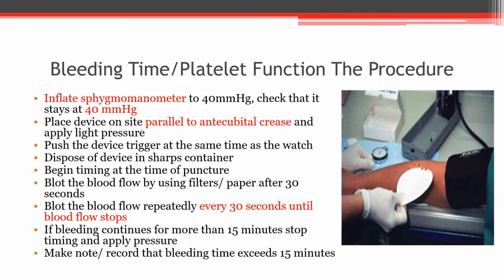Blot the blood flow using filter paper after 30 seconds. Blot the blood flow repeatedly every 30 seconds until blood flow stops. If bleeding continues for more than 15 minutes, stop timing and apply pressure. Make a note that bleeding time exceeds 15 minutes.